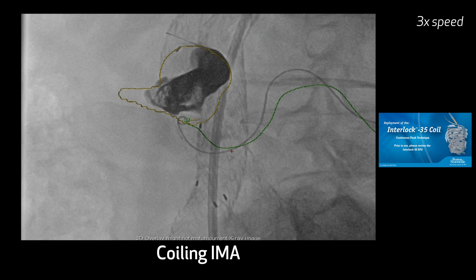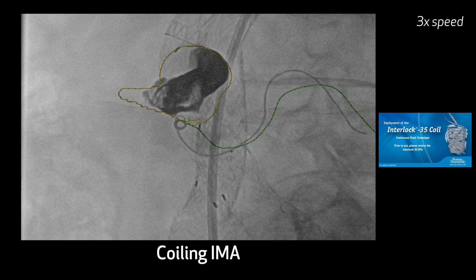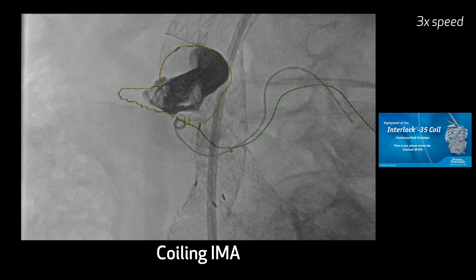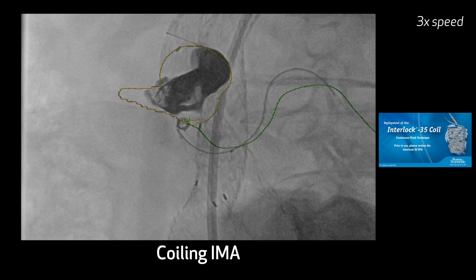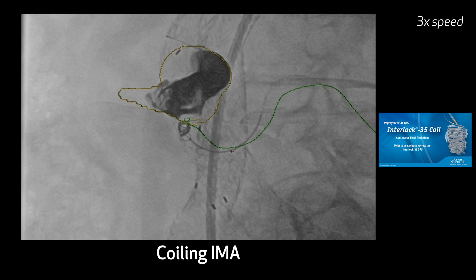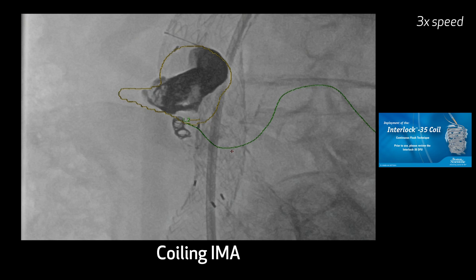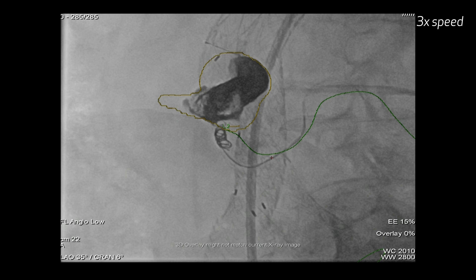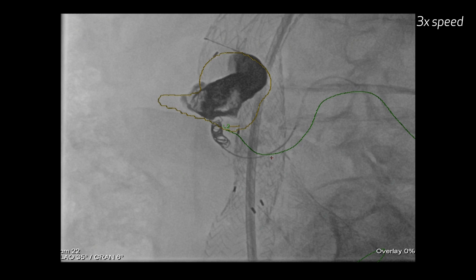Now we're starting to drop these coils in. These are interlock coils, probably five or six millimeter coils — we use relatively short ones. I don't want to put a real long one in there; I'd rather put two or three in so we have control over it. It's always the last coil we put in that gets you in trouble. You're kind of pulling the microcatheter back in advance. These are basically 0.018 coils. And that's exactly what you want to see — you want to see it coiling up like that.